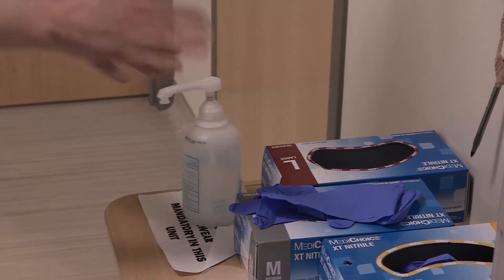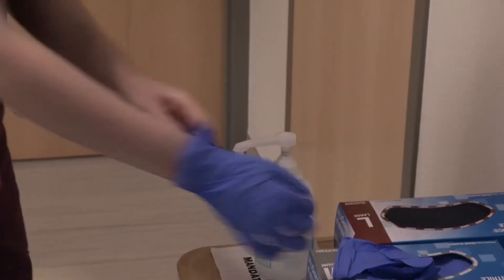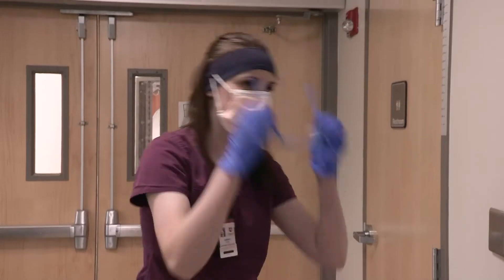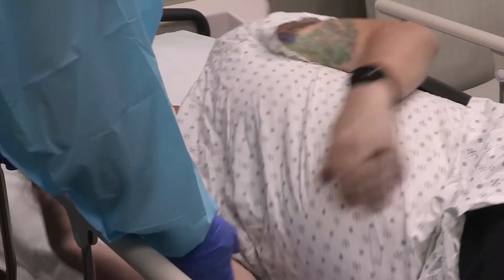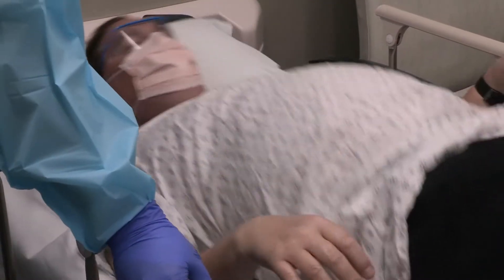The technologist will enter the unit wearing the appropriate PPE. There may be a variation in the types of PPE the technologist dons depending on supply issues and current hospital guidelines.